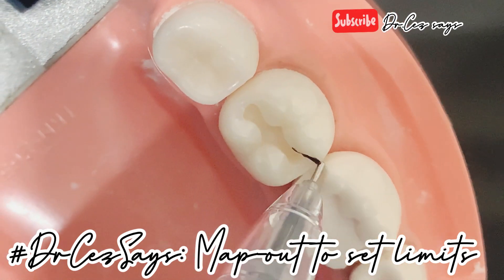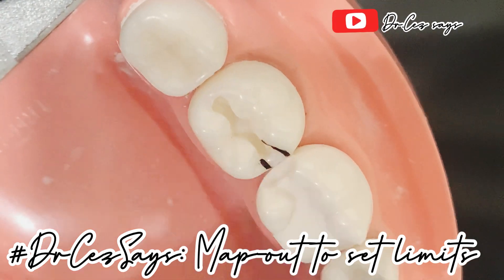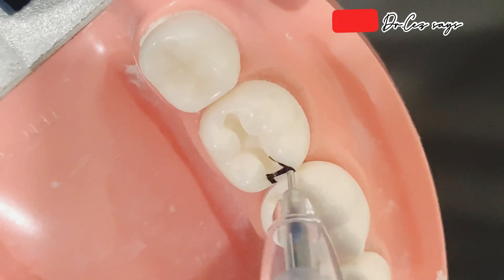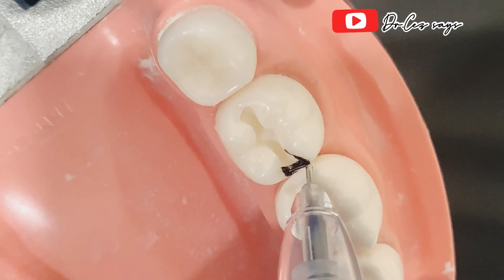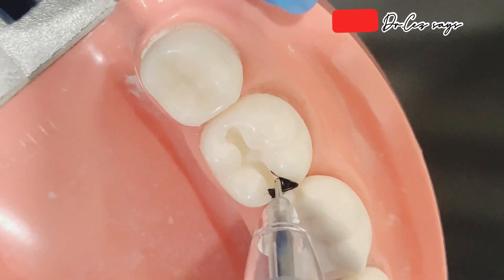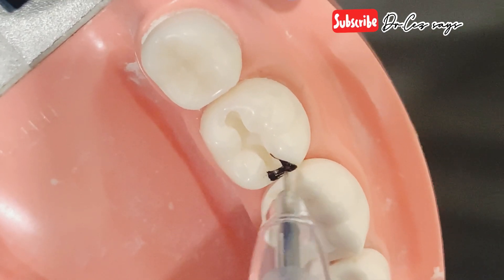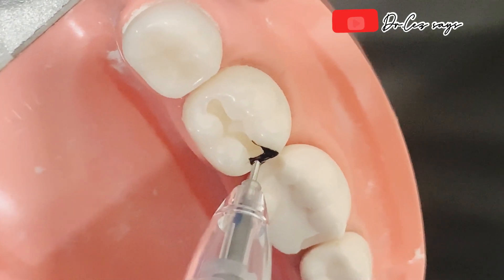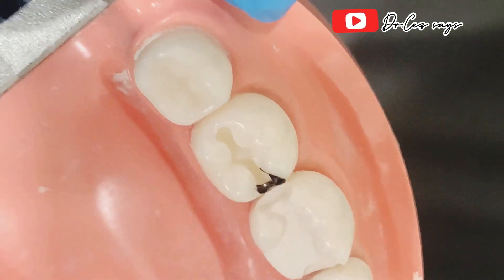So you know that your buccal limitation is here, and your lingual limitation is here. Sometimes what I do is shade the area so I don't get lost. So 0.5 of contact, and also on the lingual, 0.5 of contact. So as you see here, this is my Class 1, and I am now going to connect it with my Class 2.